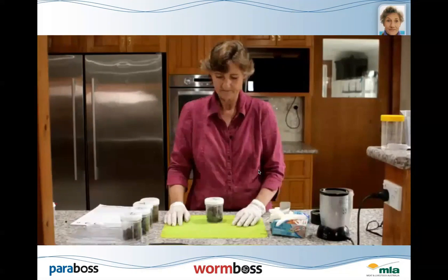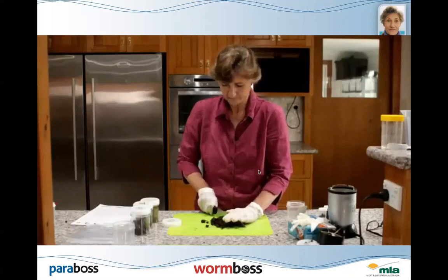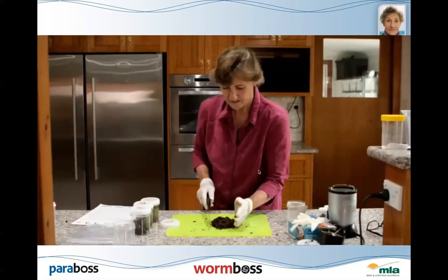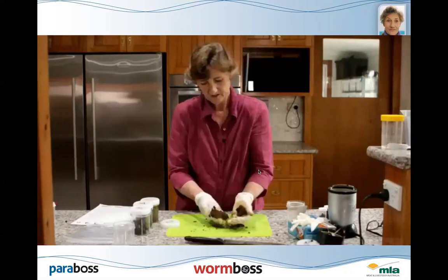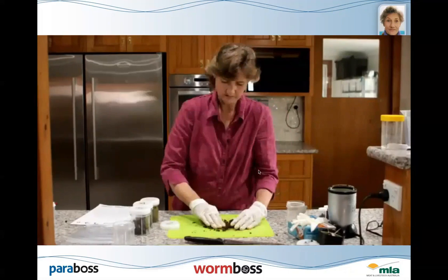Sometimes though, your samples will be quite gluggy, and I can tell you they don't do well in the blender. They'll just blast around the side and clag up the little blades. So I find that if I chop them up with a knife for a little while, and then I sort of knead them a bit like bread dough and squash them back and forth, whatever you do, you've just got to make sure that you really do a thorough job of mixing them.